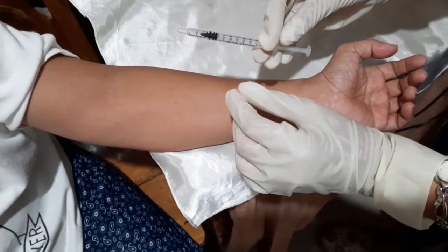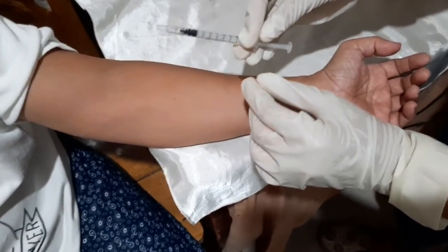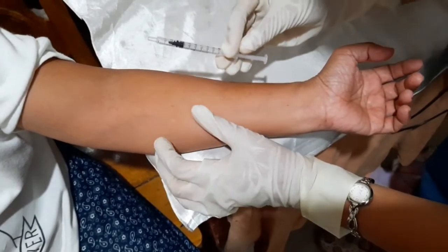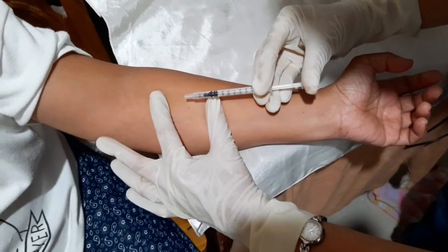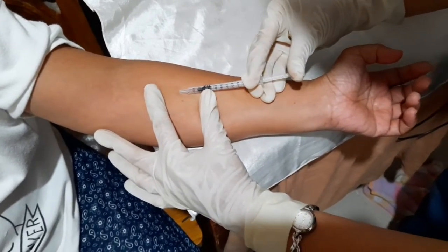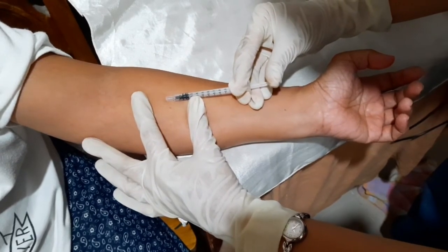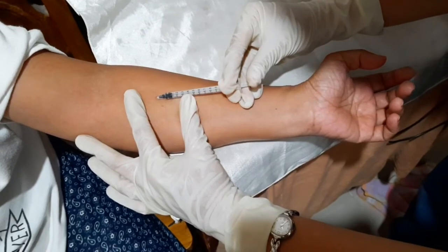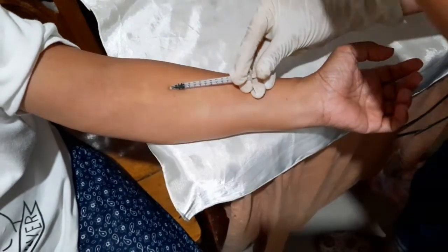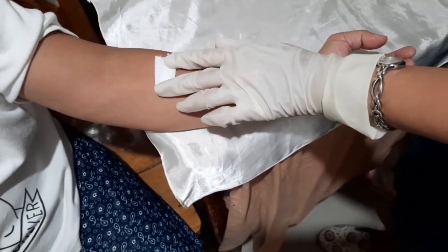Remember, just barely above the surface, 5 degree to 15 degree angle, okay? Slowly. And then cover it. And then don't massage it.